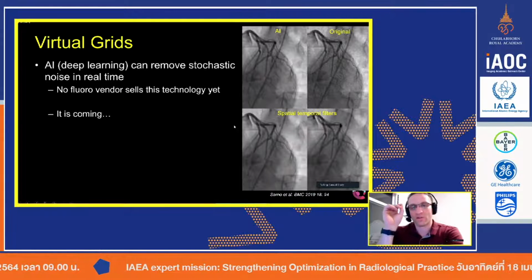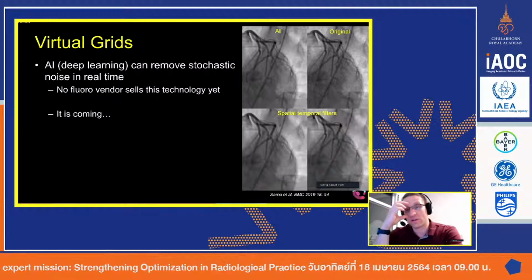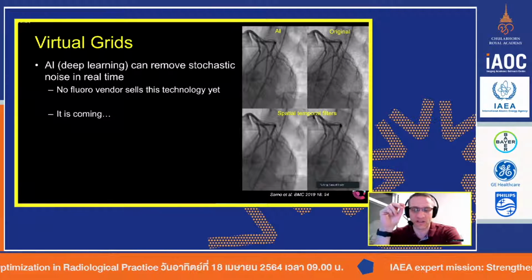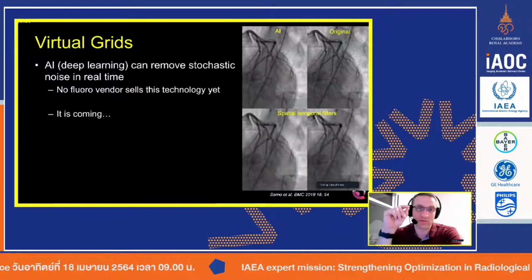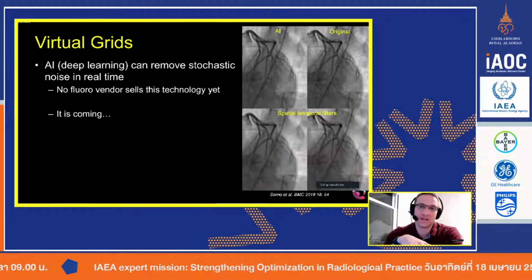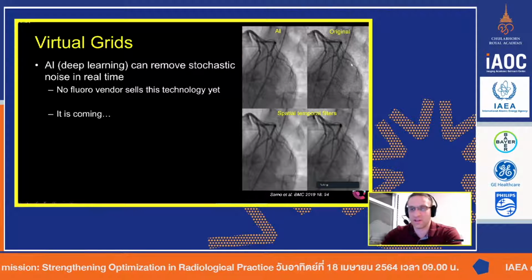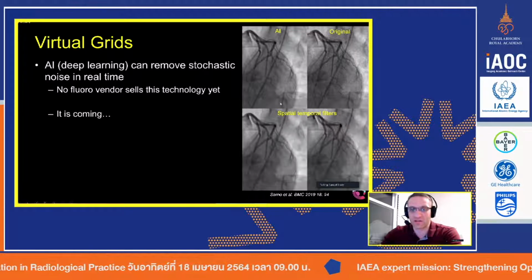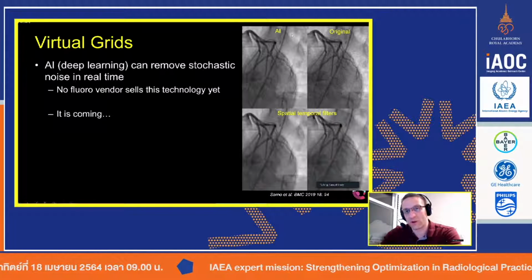All right, so we want to reduce the noise. That's the whole point of collimation and grids. We talked a little bit about this idea of new reconstruction techniques coming out. This is kind of the future, and it's still very much being debated. I showed you some images a couple of weeks ago in CT using this new deep learning AI technique. This is an example of fluoroscopy: noisy image, then AI, nice and clean. The noise is basically gone. The structures are still pretty strong. You could probably see all the edges.